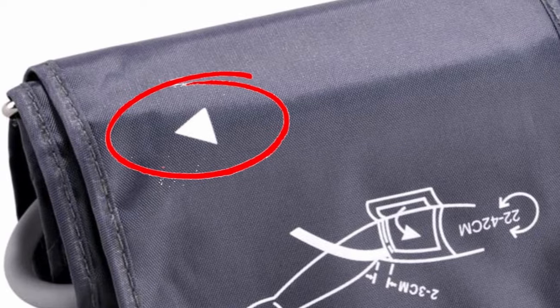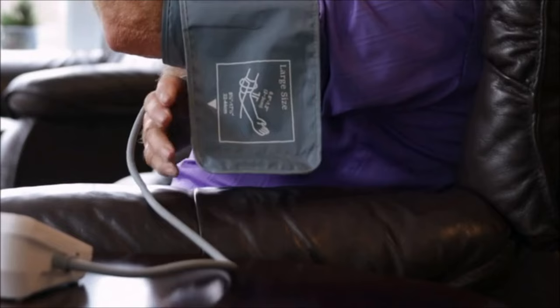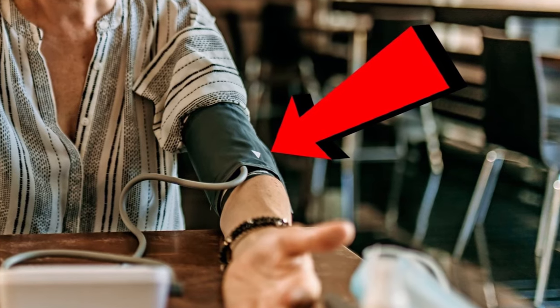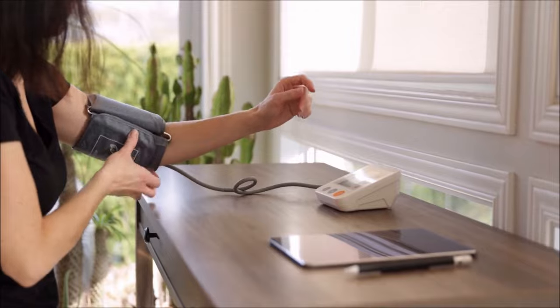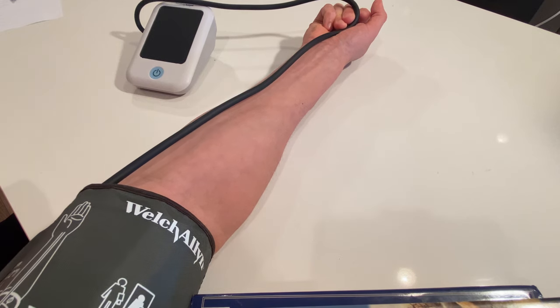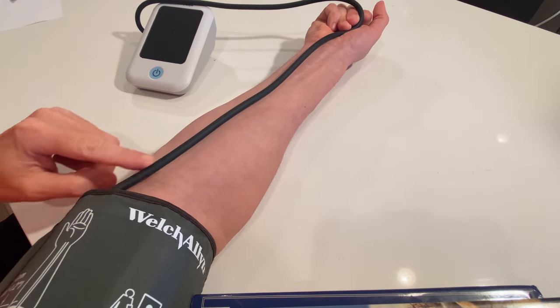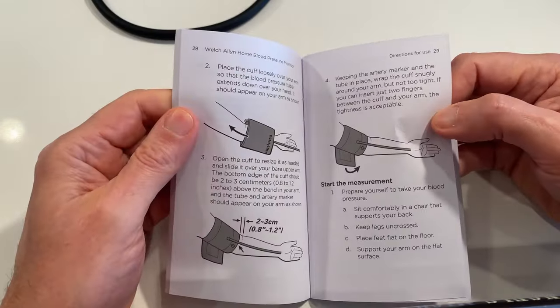The next scenario is when there's an arrow on the cuff and no other markings. For this style cuff, the arrow is typically an artery marker. But if you're unsure about the arrow or there's no arrow at all, just remember: when the cuff is secured correctly, the air supply tube always runs down towards your hand. You can also check the user's manual if you have it.